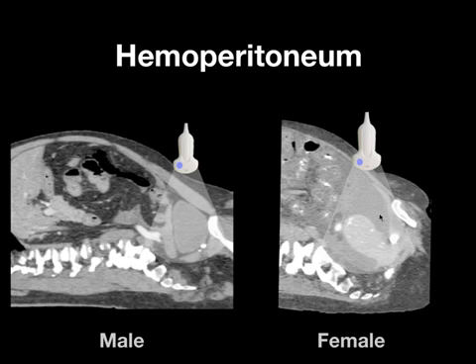On this female patient, the urinary bladder is not full, but you can see here's the outline of the uterus, and here you can see a large amount of fluid displacing the bowel away, and you can see that there's the fluid in the posterior cul-de-sac extending into the anterior cul-de-sac.